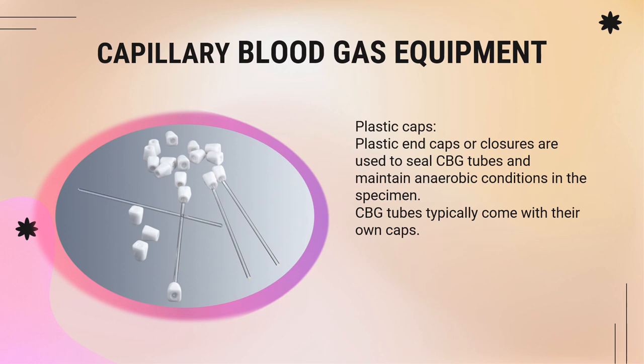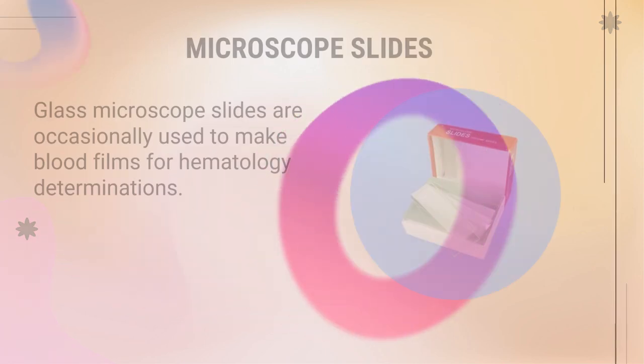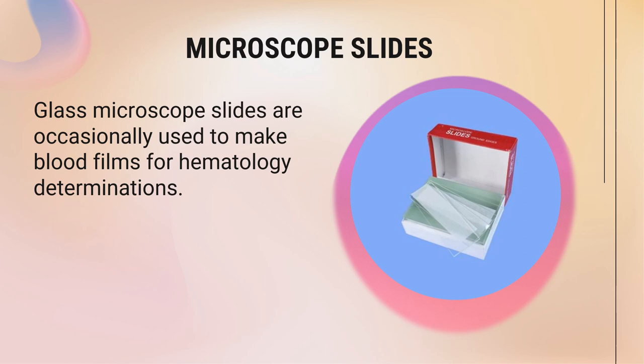So you also have the plastic end caps or closures. They are used to seal CBG tubes and maintain anaerobic conditions in the specimen. CBG tubes typically come with their own caps. Another equipment, we have the glass microscope slides, occasionally used to make blood films for hematology determinations.